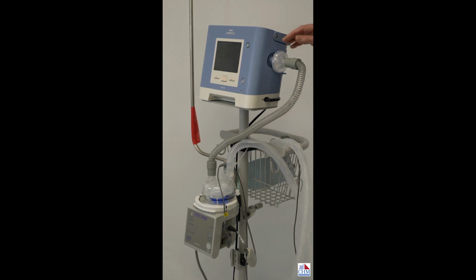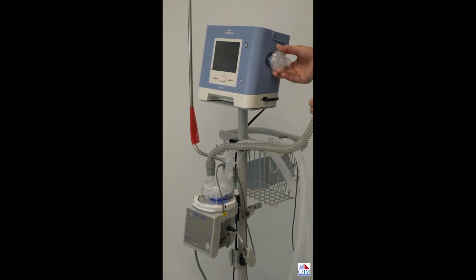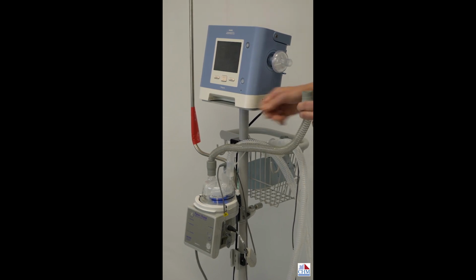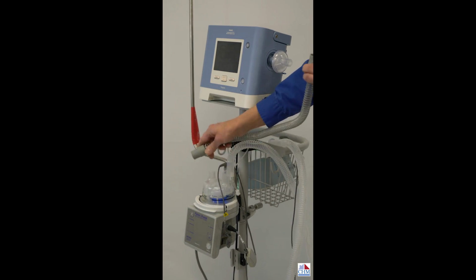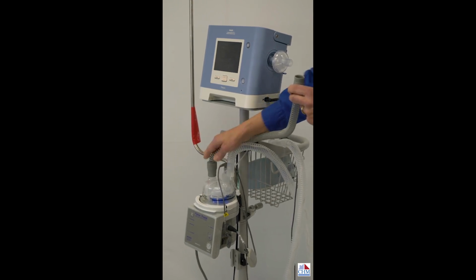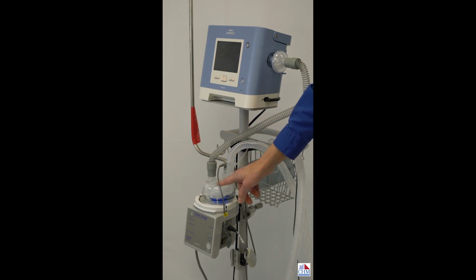What we've got coming right out of the side of the Trilogy ventilator, this is where the airflow comes out, I've got a bacteria filter. This is a disposable bacteria filter. It filters down to very small particle size so that it's safe to provide that air right directly into a tracheostomy for a patient. And then there's a short tube. This one is about 2 feet long, and think of it as a conduit for the airflow that goes from the machine through the filter down into the humidifier.